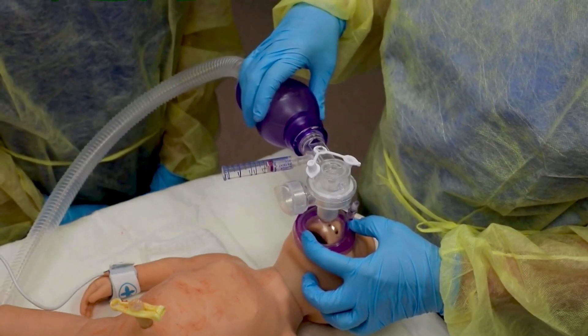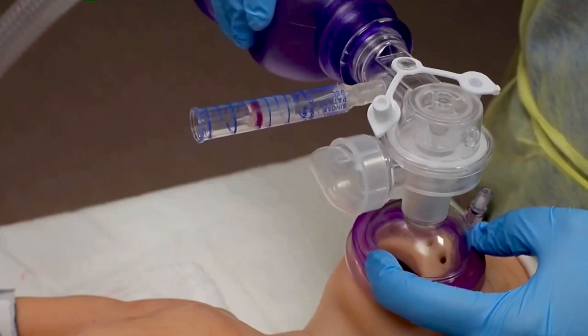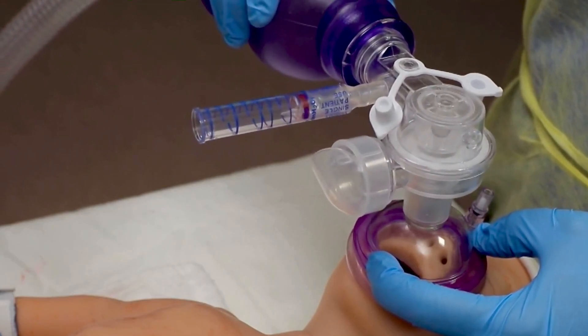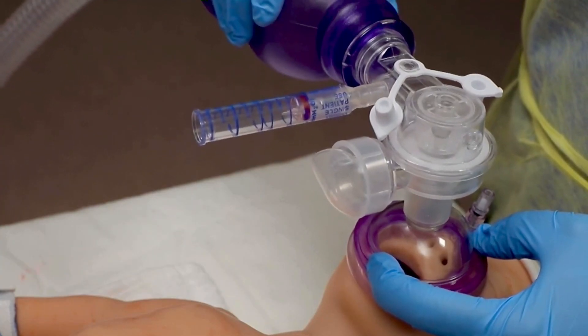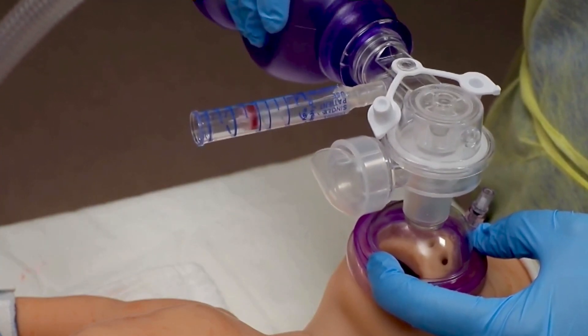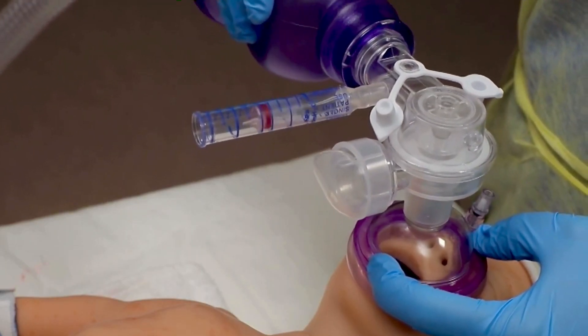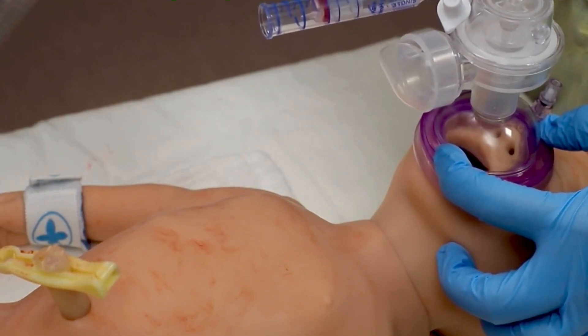Breathe 2-3, breathe 2-3. Start with a positive inspiratory pressure of 20 to 25 centimeters water. Full-term babies may require up to 30 to 40 centimeters water for their first few breaths to inflate the lungs, then need less pressure to maintain chest movement. You should see a gentle rise and fall of the chest, not very deep breaths.